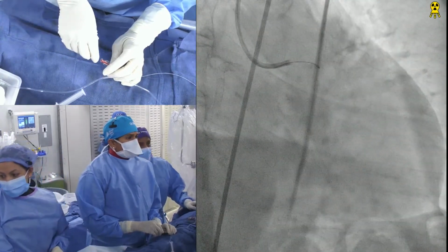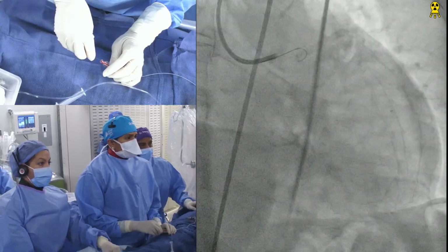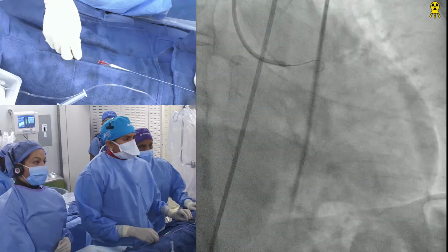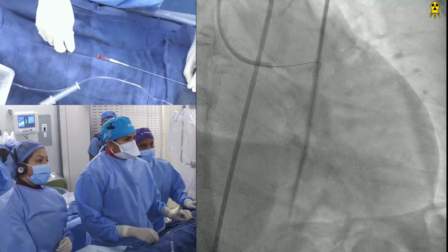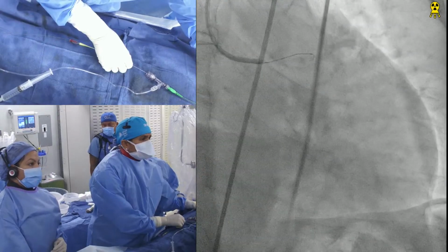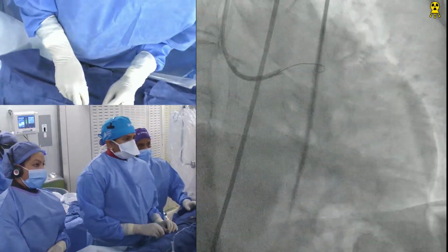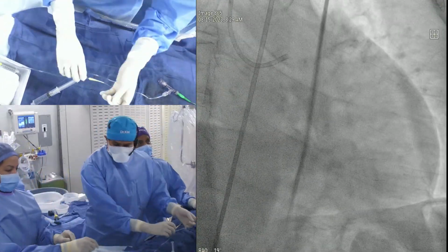Yeah, good. What happened here? A little dye. Even the Fielder made that. Yes, this is a Whisper. Viewers can appreciate when I called it an exceedingly complex angulated lesion. Anu really wanted to do this case for the CCC because we had done tremendous bifurcation rotablation of both vessels, which has been a lot of teaching points and a lot of our archives. But this kind of case is very rare, and for CCC Live this is one of the most angulated cases. We have done one for India Live.